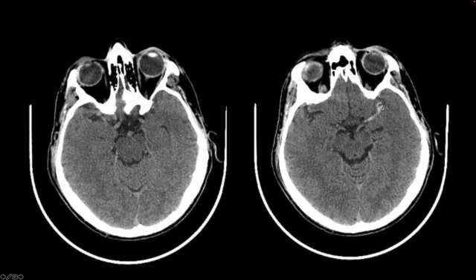Here's that same slice again. And here's a slice just adjacent to that where you can see more of the internal carotid artery, the distal internal carotid arteries. And here's the middle cerebral artery on the right side — you can see it's much less dense, very asymmetrically less dense than this vessel here on the left, which has thrombus in it.